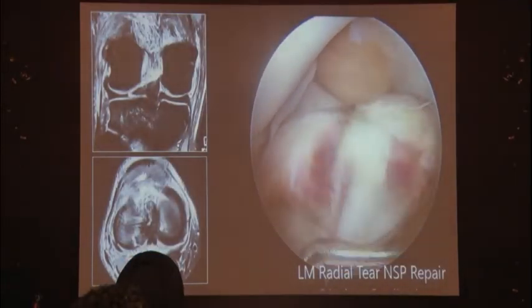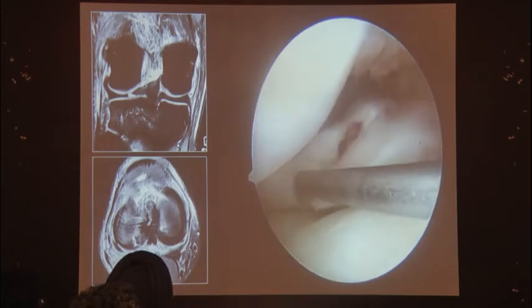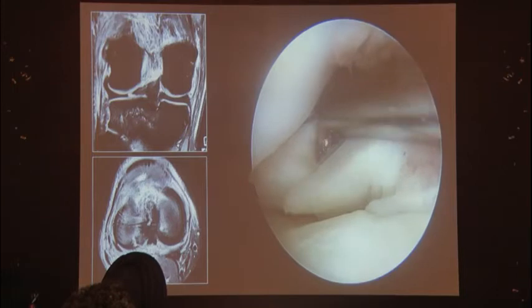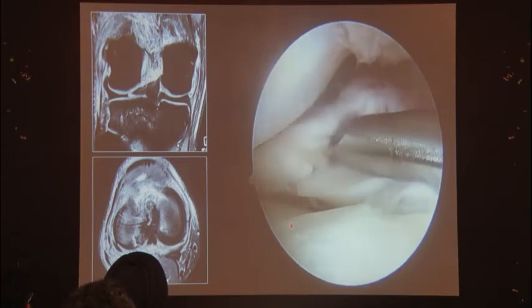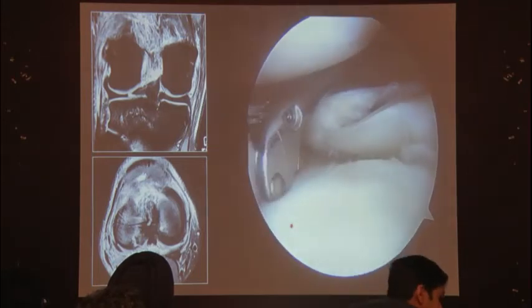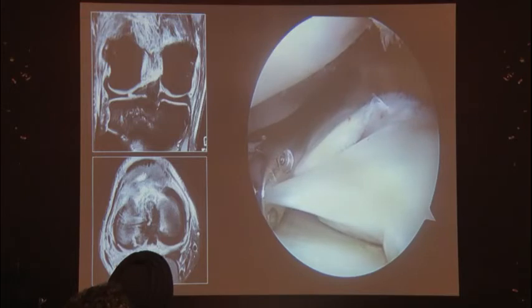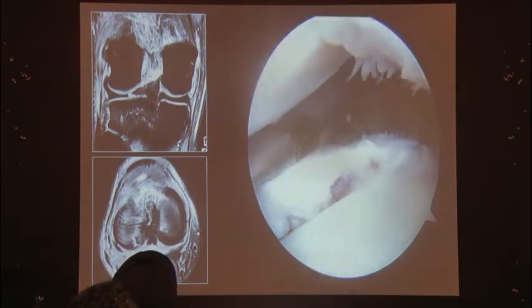For radial tears: here's a classical acute radial tear of the lateral meniscus. First, you go ahead and rasp it to freshen it. For relatively fresh tears associated with an ACL, I go straight for repair without adding any clot. For the repair, the instrument comes in with only the upper jaw, then you push the lower jaw in once you've engaged the meniscus. A black mark on the device tells you exactly where your suture is going to come out, so before you throw your bite, decide precisely where it will exit.